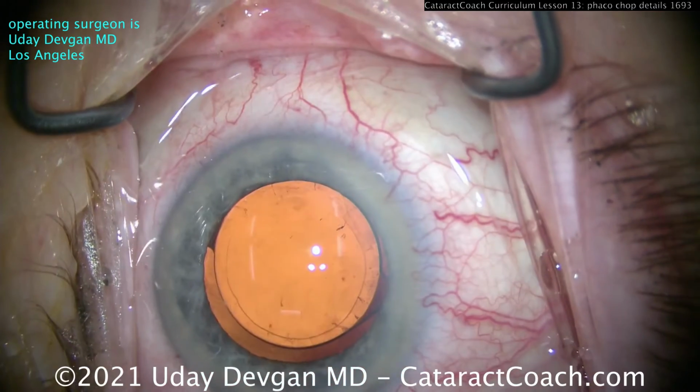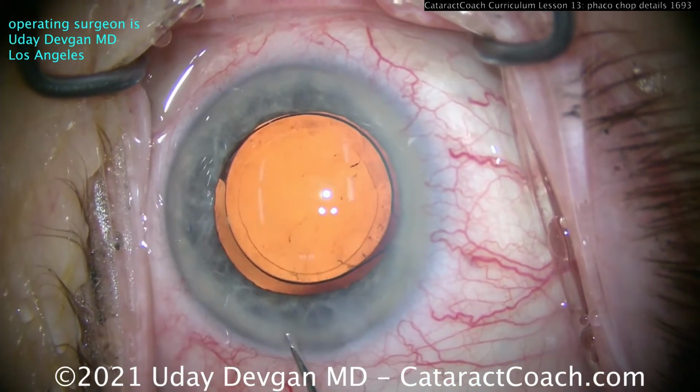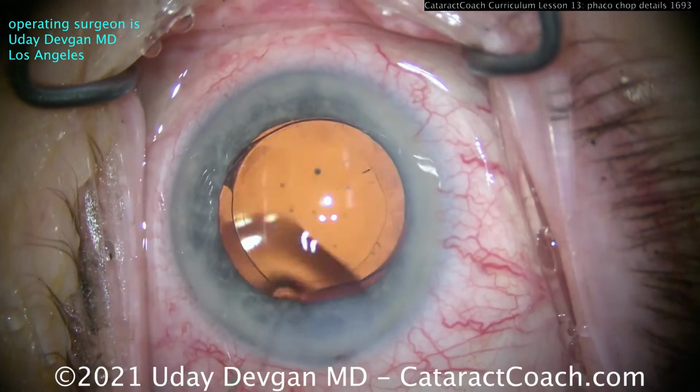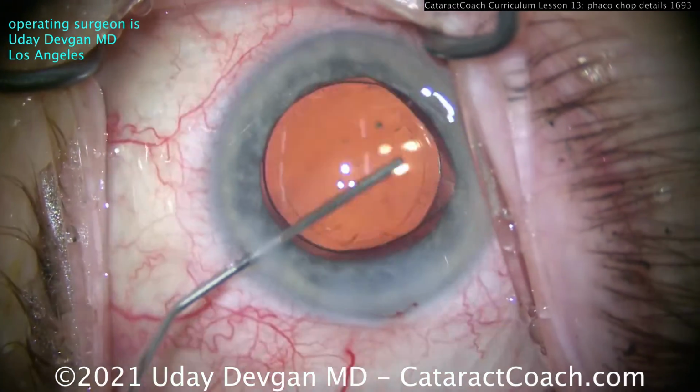I want to show you this part so you can see that it's a 5mm capsulorhexis. It's a 6mm optic. And you can see that lens is beautifully centered. That looks great. Seal up the incision here. This was a bare minimum amount of phaco energy, a very efficient case. Very little fluid was placed through the eye.